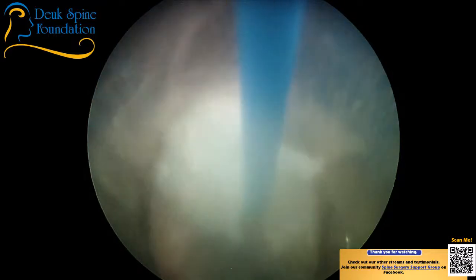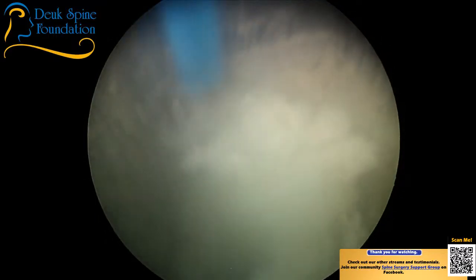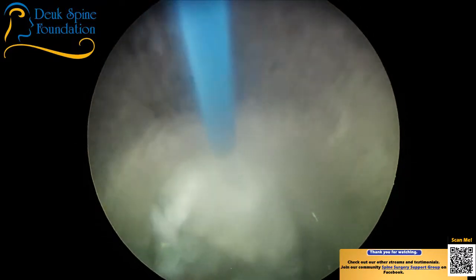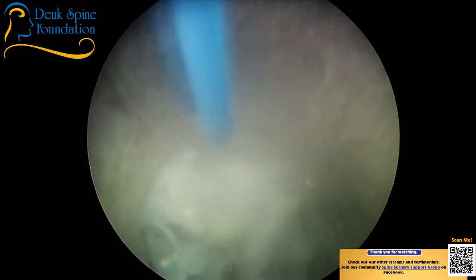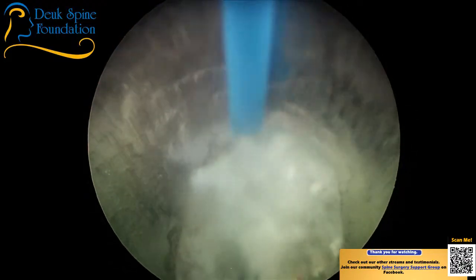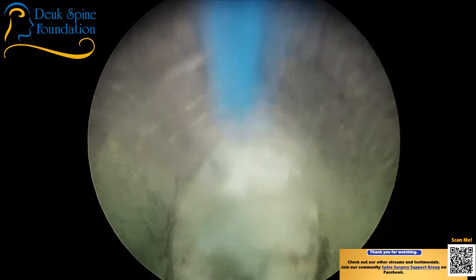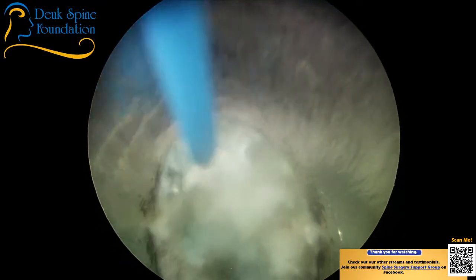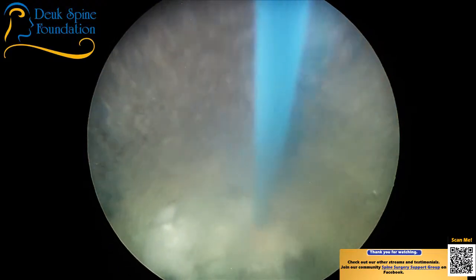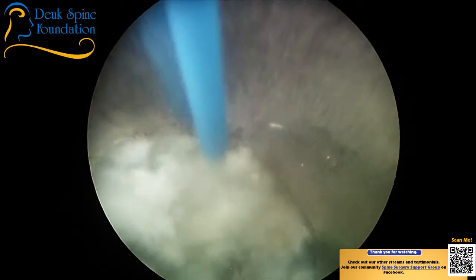So why aren't we fixing scoliosis? Because we don't need to. Scoliosis surgery, this is the tear, by the way. This is the source of her pain in her back. So remember we tested L3-S1 and she said, yeah, that's my typical pain. L4-5 is also painful, and I believe that's a source of her pain as well. But she said no, but I think it is. Unfortunately, I don't think that was a very reliable answer. And the reliability changes because of the circumstances, right? We're in the operating room.